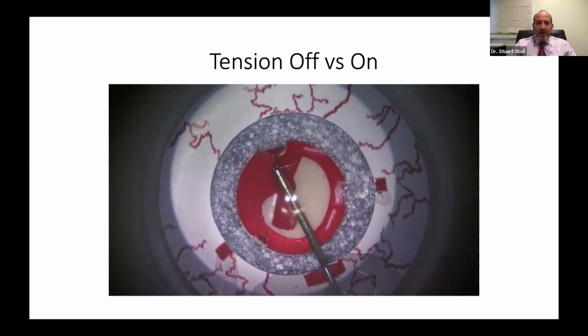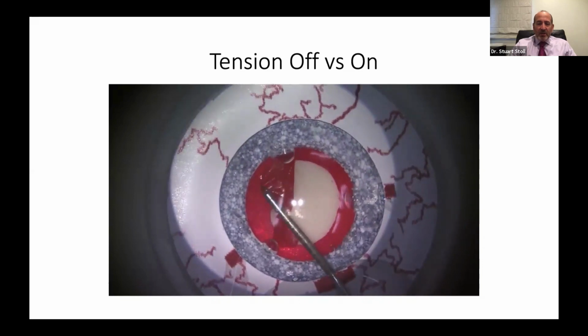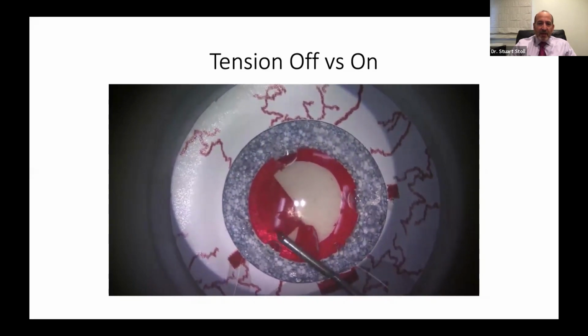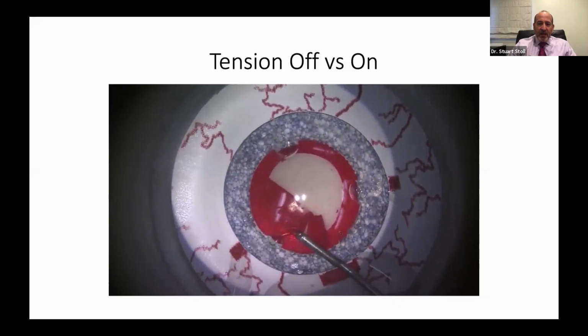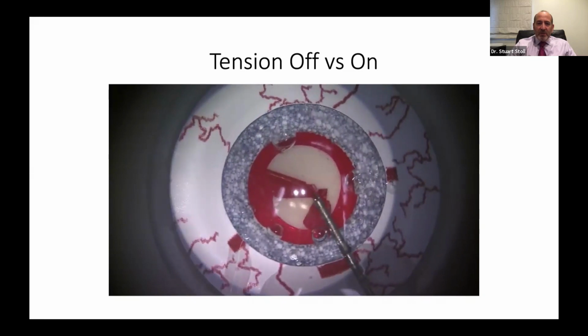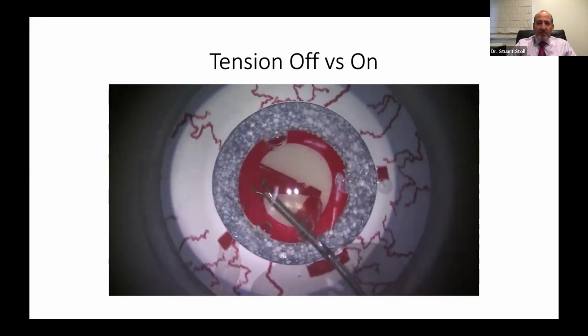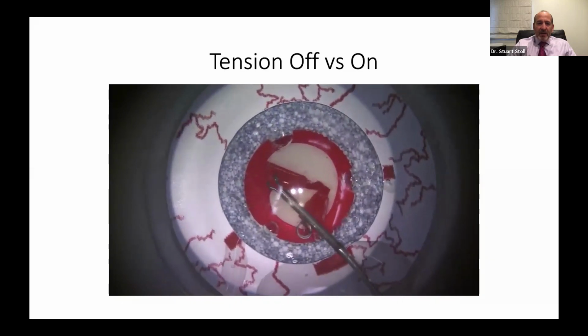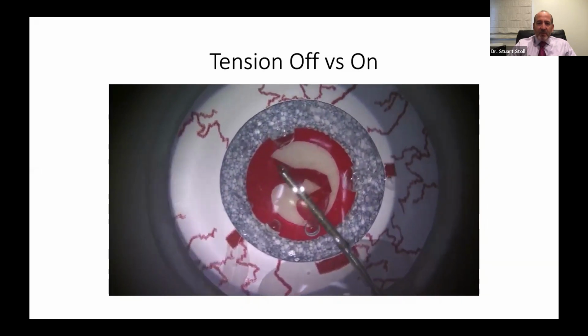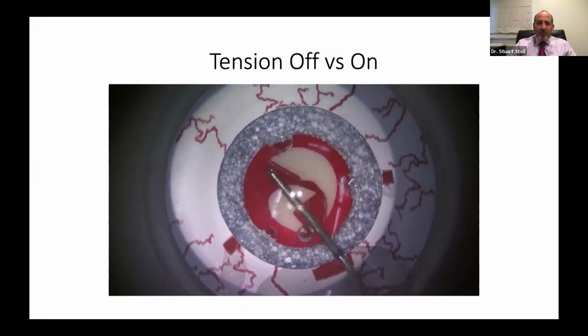And here we go around a little bit more. We're tension on now. We're opening the capsule. The tips are staying out. We're tracing the point. The capsule's folded over. We got to our 10 o'clock position. Reposition the capsule. Get it in a nice position to grasp. And I'm going to grasp a little bit too far back, but just for demonstration, we're going to bring those tips right down towards the point of propagation.